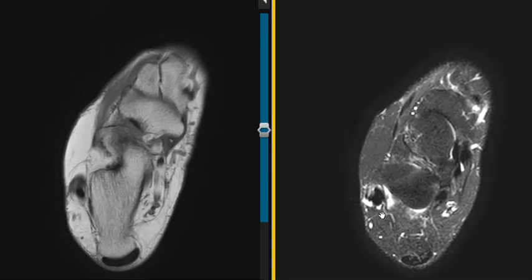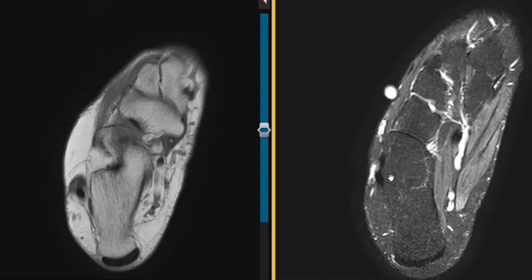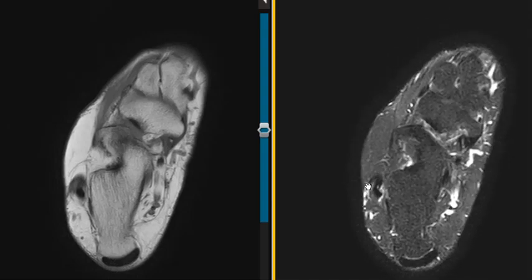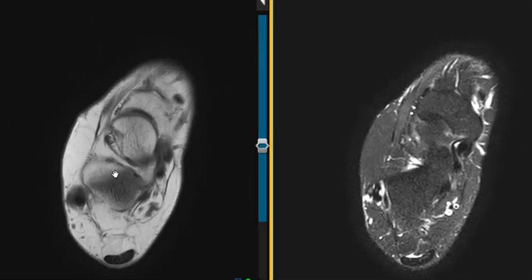On this view here, we see two components. Here's an inner and outer component, so a longitudinal split tear of the Peroneus brevis. Here it comes back together. Here it splits apart into the two components. So the real reason I'm showing this is because of this little fat collection right here.